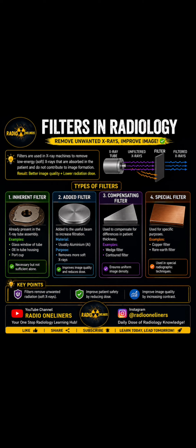Now let's discuss the benefits of this added filtration. The first benefit is that it helps us improve image quality by increasing contrast and reducing the patient dose. Second, it also reduces radiation dose to the patient, indirectly improving patient safety. With added filter, we ensure better image sharpness but less unnecessary exposure to the patient. This is for the added filtration.